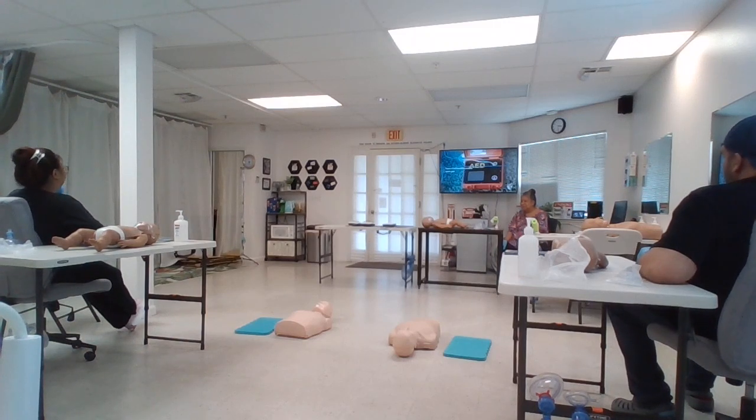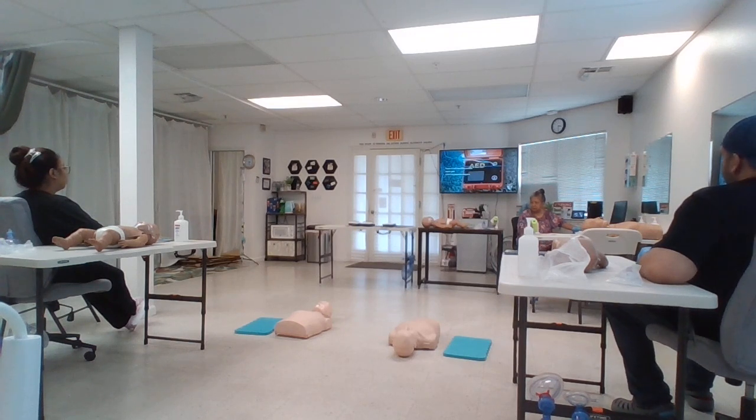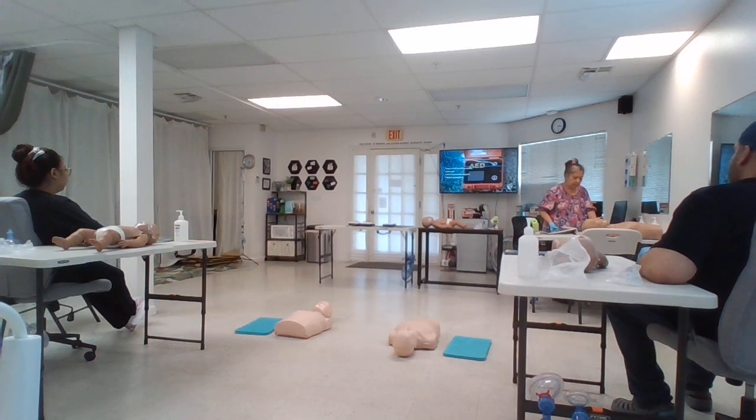Attach the AED pads to the victim's bare chest. Follow the placement diagrams on the pads. The AED will prompt you to clear the victim so that it can analyze the heart rhythm. If the AED advises a shock, it will tell you to clear the victim. If no shock is needed and after any shock delivery, immediately resume CPR, starting with chest compressions.